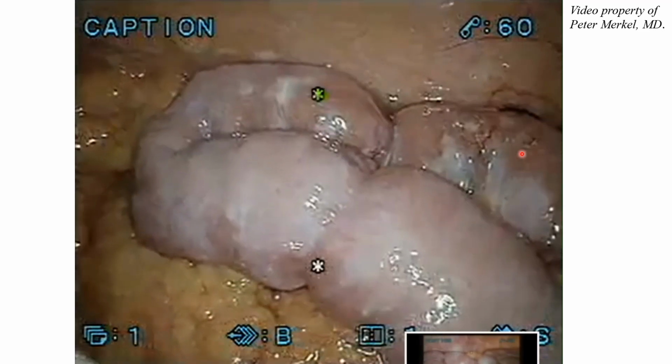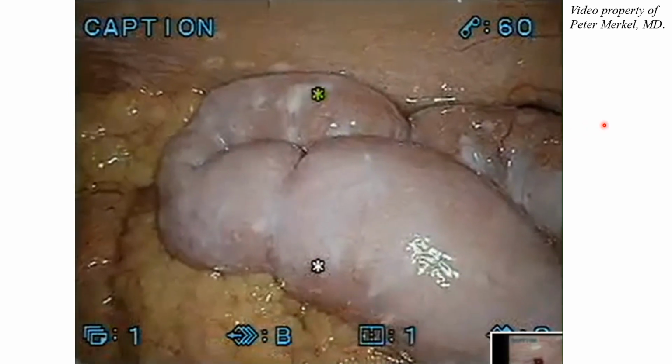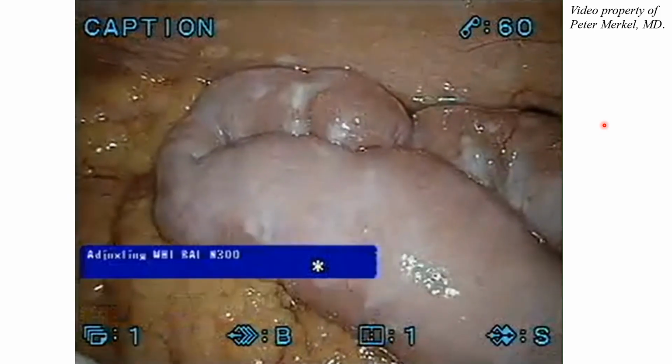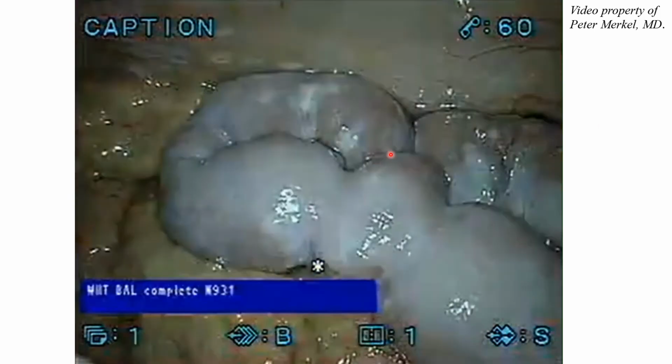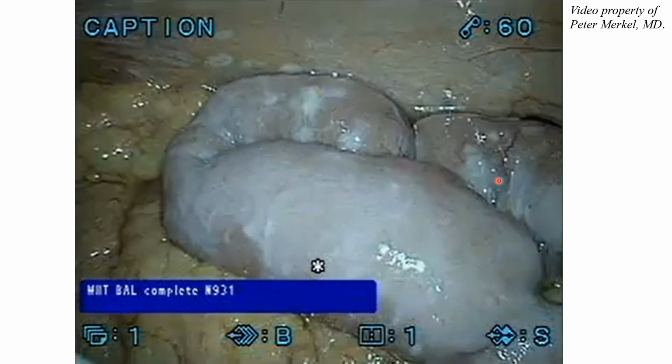It may be difficult to figure out what is a plaque and what is glare, and therefore getting a proper visualization of these lesions and using different lights that may better highlight what these plaques look like is necessary.